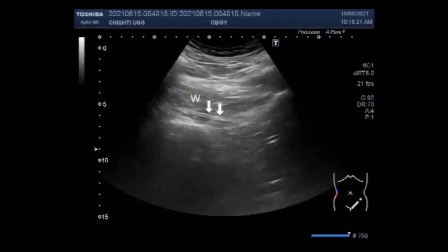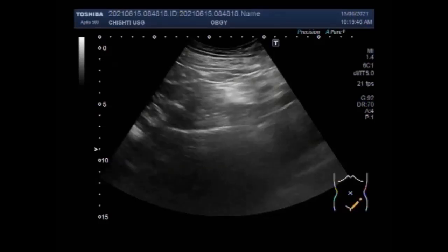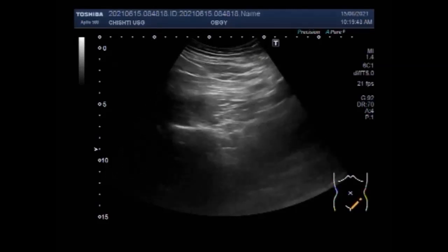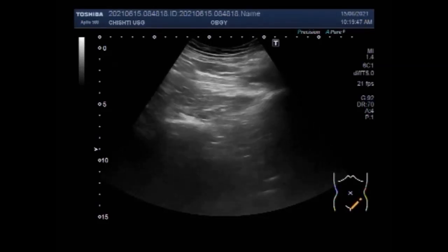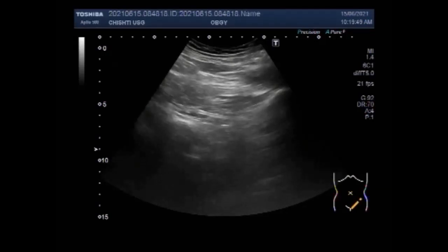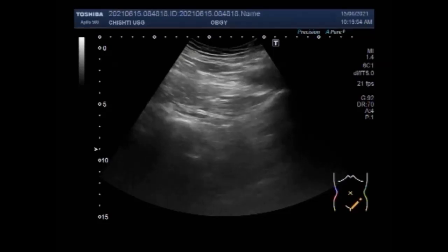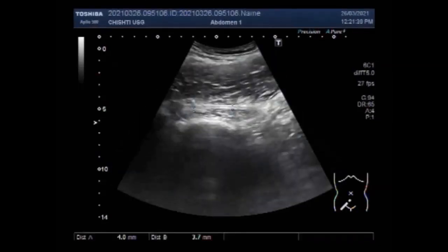You can see in the video this is the worm, and this is possibly the tapeworm. Ultrasound will depict the adult worm as a hypoechoic tubular structure with well-defined echogenic walls. During real-time evaluation, the worm can be seen making curling movements.